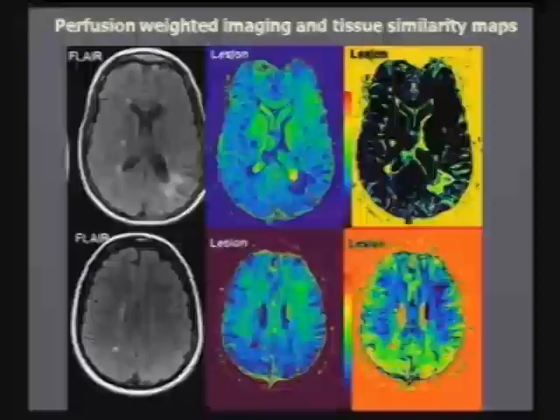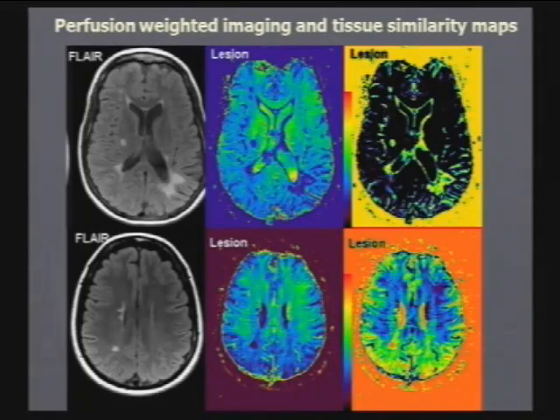So you can see here that if I draw the following area here, I pick up all these other lesions. That suggests to me that the vascular connectivity of these lesions are all related, maybe because they're related to the same venous drainage system. But it's pretty amazing. We've done this in 10 cases now, and if I draw the lesion here, I pick up this entire area by the ventricles, showing that they have exactly the same vascular functionality associated with them.